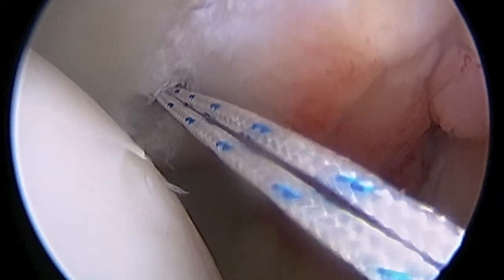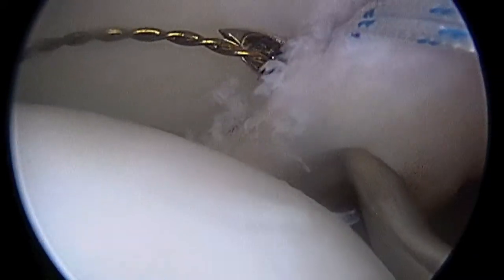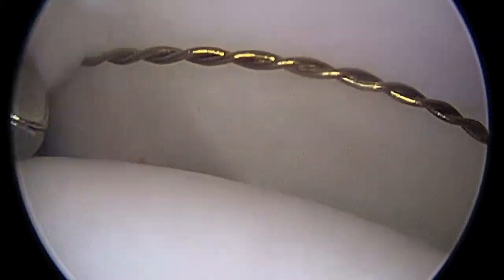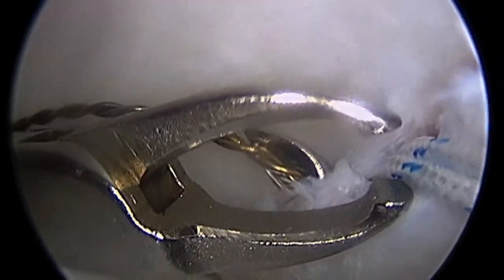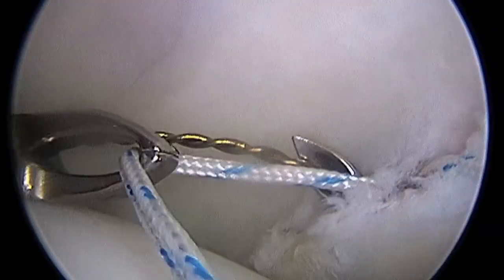There I'm targeting my first anchor, and once it's drilled and in place, you can see the sutures firmly fixed to bone. Now I'm going to use that special suture passer we spoke of to pass one arm of the suture at a time through the ligament and labral complex. Here you see my assistant coming in from the back portal, retrieving one arm of the suture.